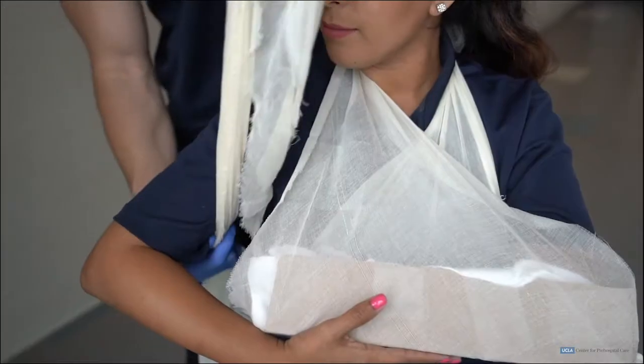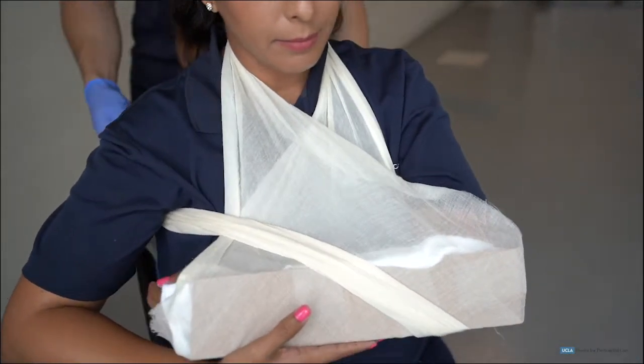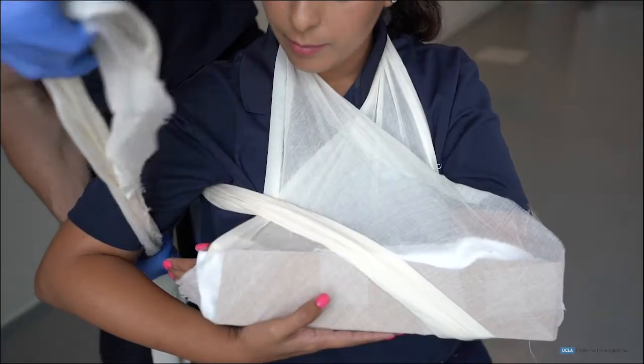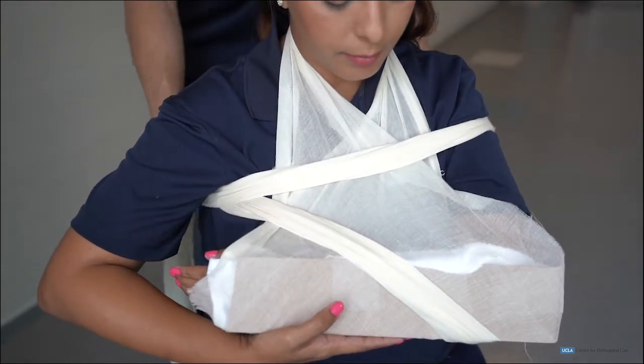You will see two swaths being used here to secure the patient's humerus to the body. The entire injured extremity is now immobilized.